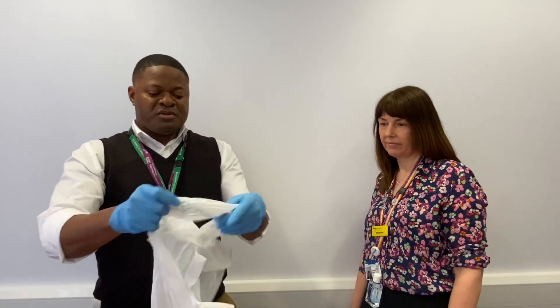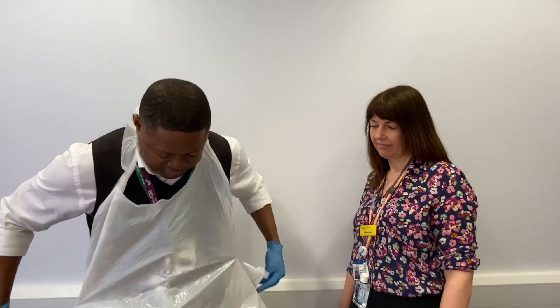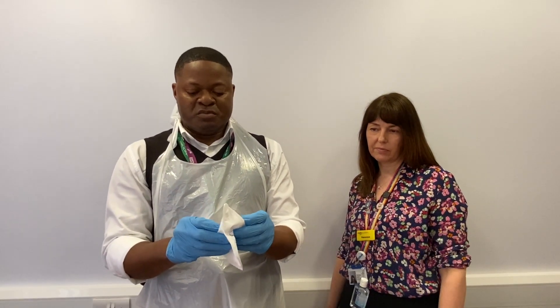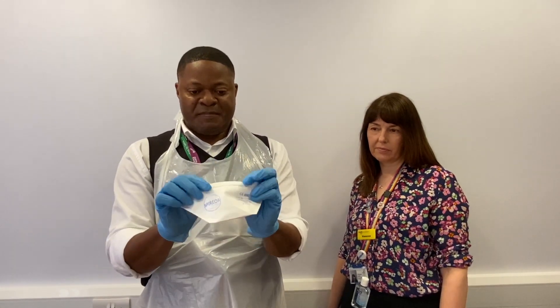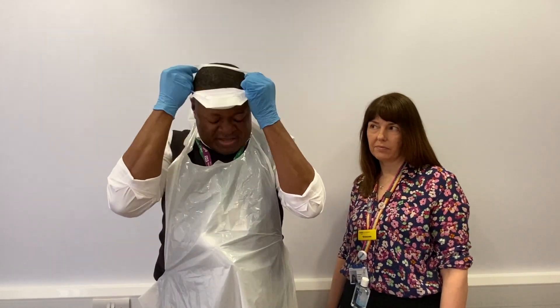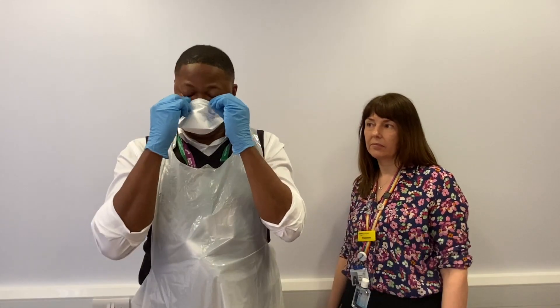I've got my gloves on. The next thing to put on is my apron — your normal apron is okay for suspected cases — and make sure it's nice and secure. Here we go. Next thing to put on is your mask. We have different ones; this is just a normal surgical mask for suspected cases. The side with the foldable part fits nicely on top as the upper surface — fit it in properly to be secure.